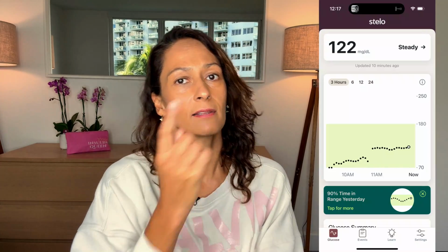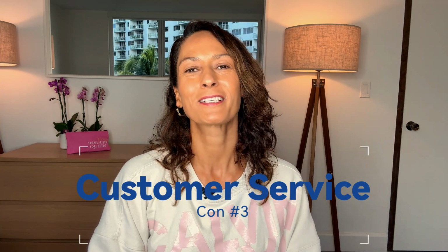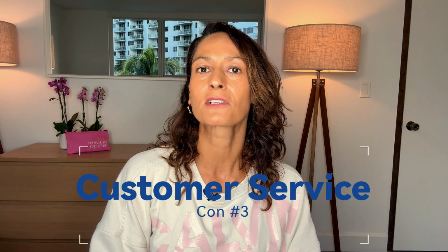I did notice signal drop a few times, like this day where all of a sudden there's a chunk of blood sugar readings missing. I did not notice this until later, and I guess I wasn't checking my blood sugars at that time.